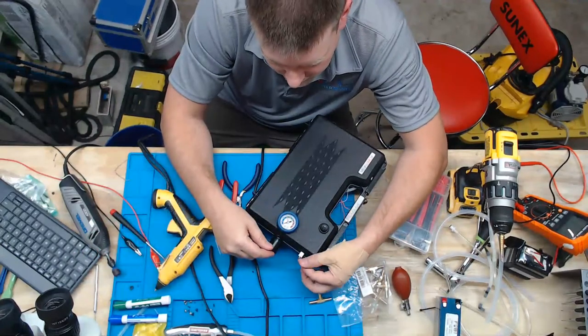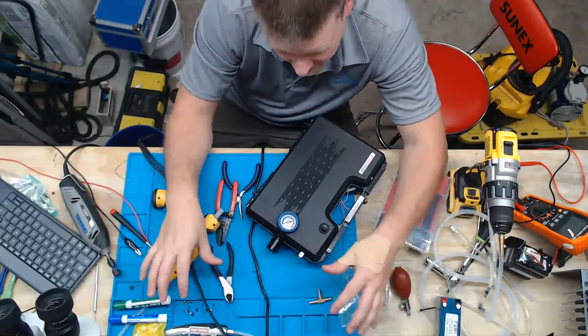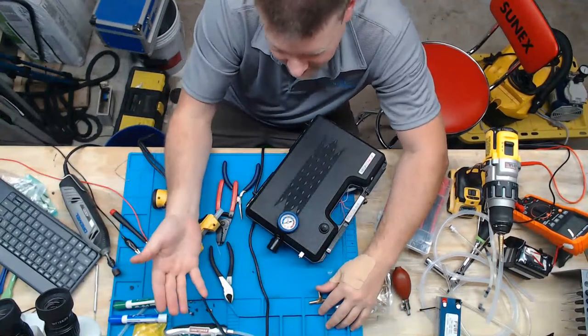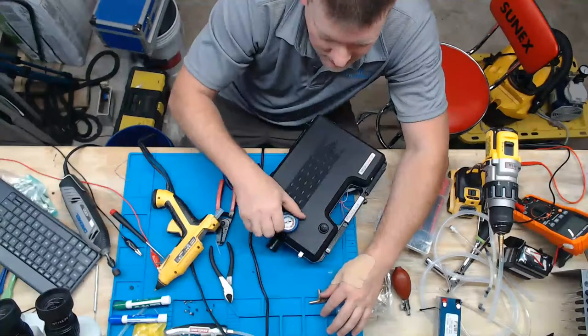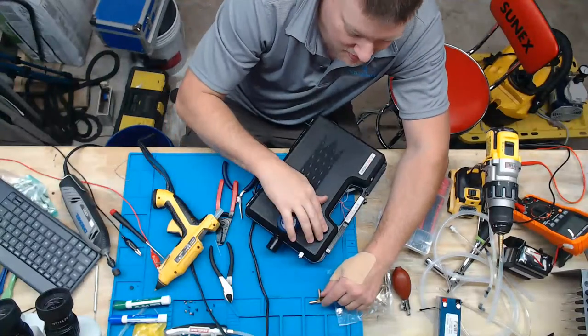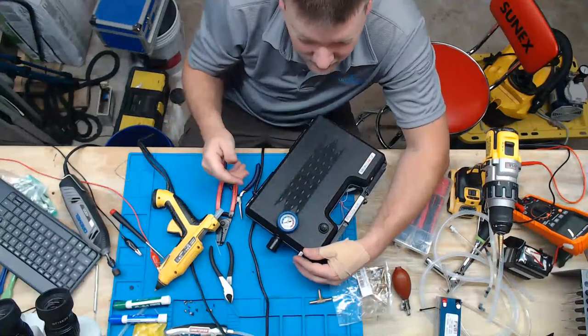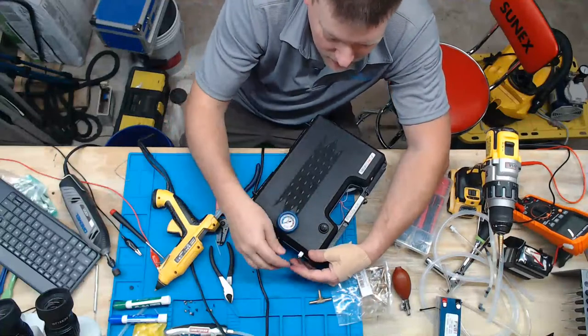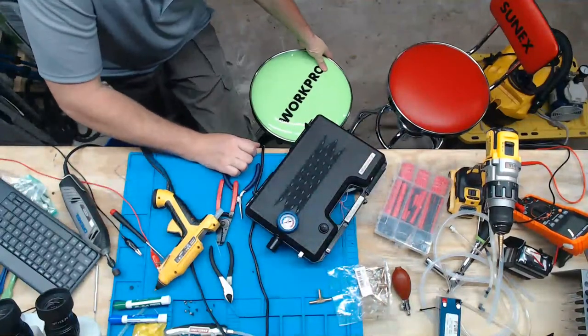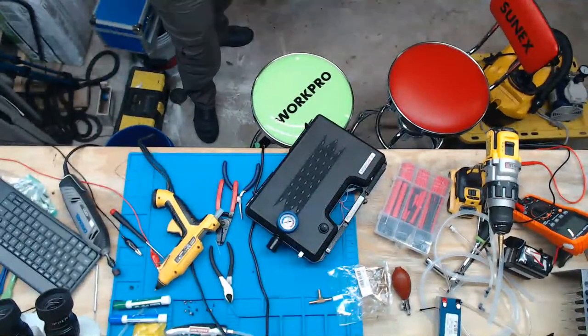So from this output, that's where you're going to have your external calibrated manometer, and then you're going to have your medical device. So this analog gauge right here is just for reference. And basically, you can do a function check, you can do a leak check, and all that kind of stuff right here without even hooking up your manometer. So I'll show you guys a little bit about what's going on.